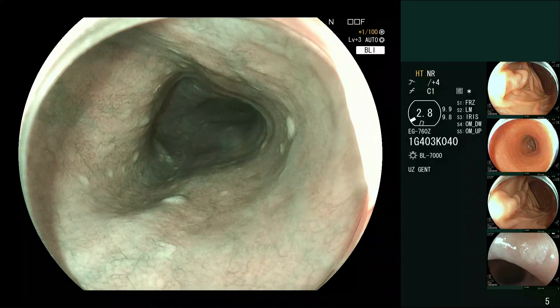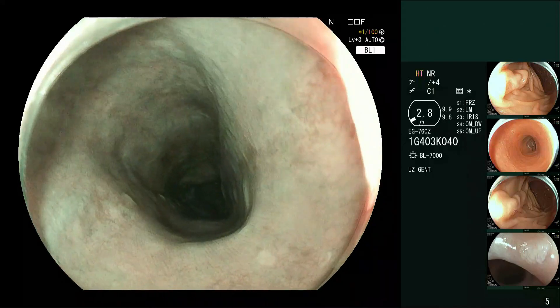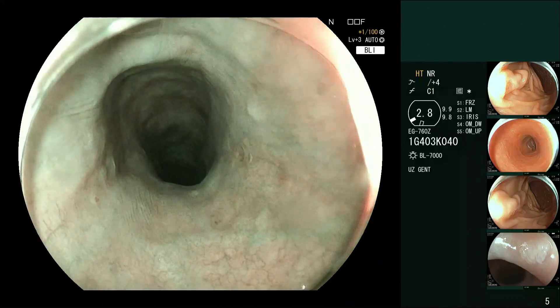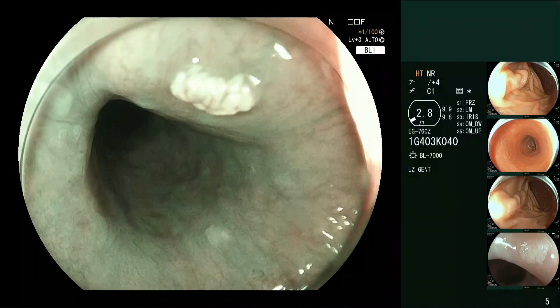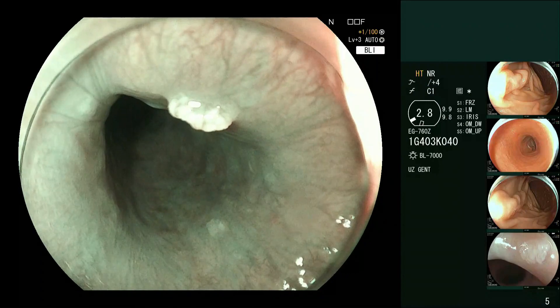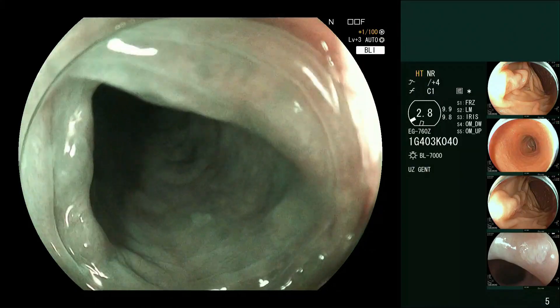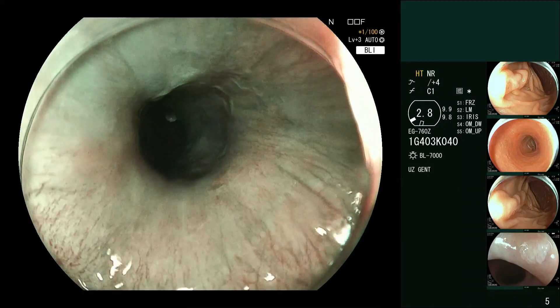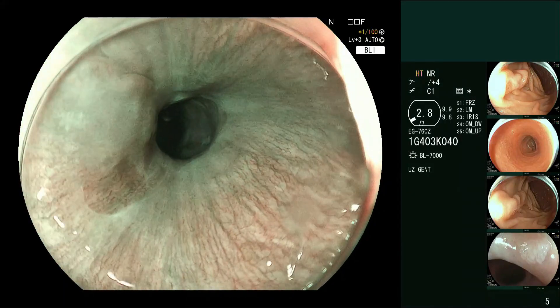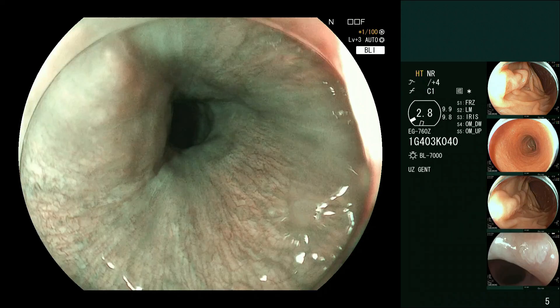As we come back slowly, maybe we'll find something. There's something standing out in white — let's have a look at that. We didn't see anything else on the way down, but before we go to that finding, let's come back and check for an inlet patch. You can see one there on the left hand side. If you're not seeing those routinely, you're not coming back slowly enough. That there at 8 o'clock is an inlet patch.